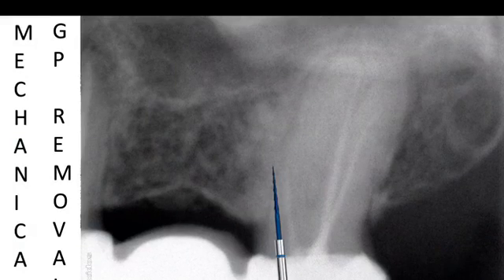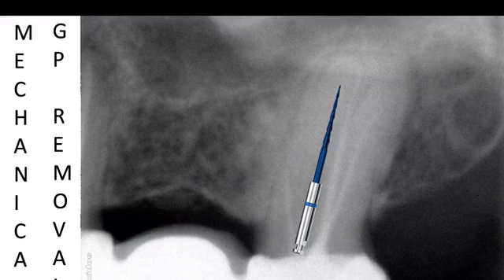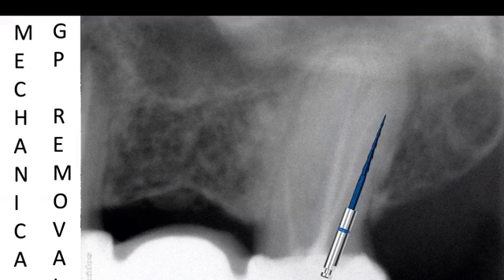And then I started doing my retreatment procedure. There are retreatment files for the Endostar, but I usually like to use the same sequence for my retreatment and for my treatment, because I want to be ergonomic. So in this case I tried to use the pre-flaring file to do the retreatment, to remove the material. And I did it without solvent because I don't like to use solvent that much, as many studies show that solvent can cause many problems, like creating a chloropercha inside the canal when we are working. So we did it in the mesial canal, only the obturated part, the palatal canal and the distal canal.